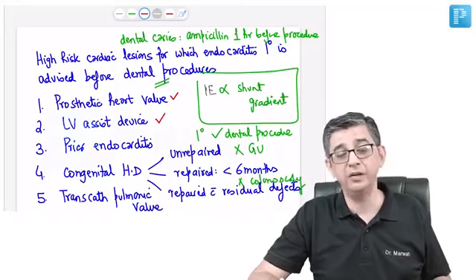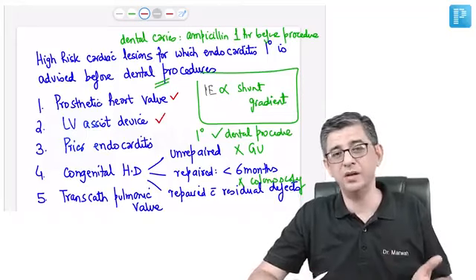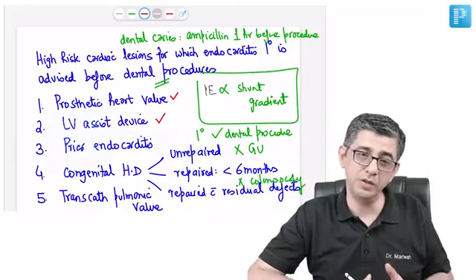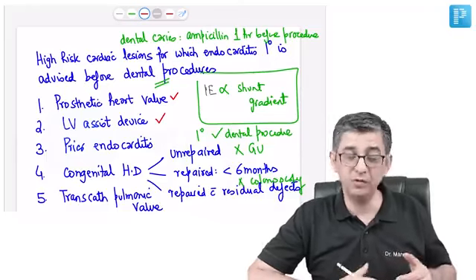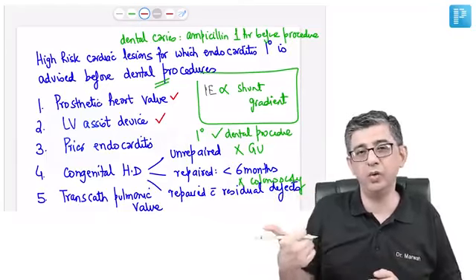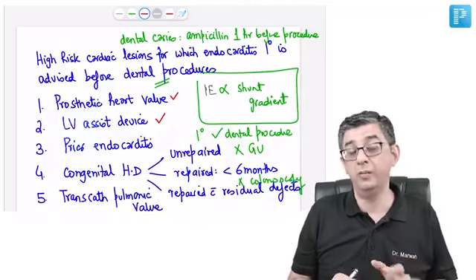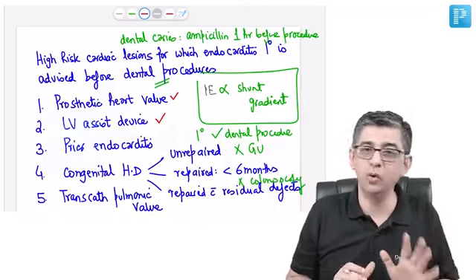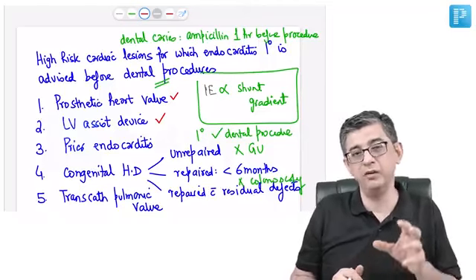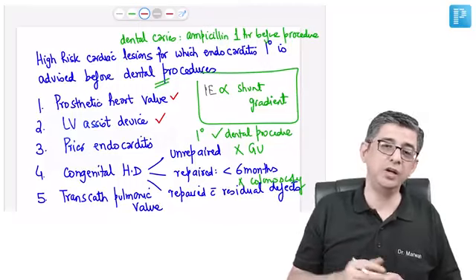This device is used for heart failure, so this is a device in the heart. The left ventricular assist device is useful for heart failure patients whose heart failure is so severe that they need a transplantation. But before they get a brain dead donor, you need a bridge. And what I mean by bridge is this artificial left ventricle. Medical science has not been able to produce a whole heart, but we have been able to produce at least a chamber that supports the left ventricle. So we call it LVAD, that is left ventricular assist device.